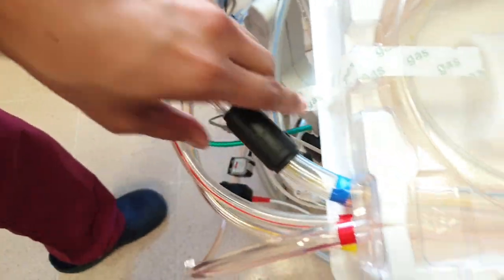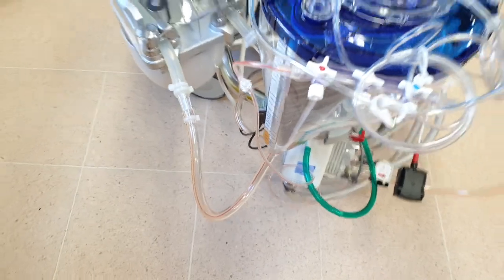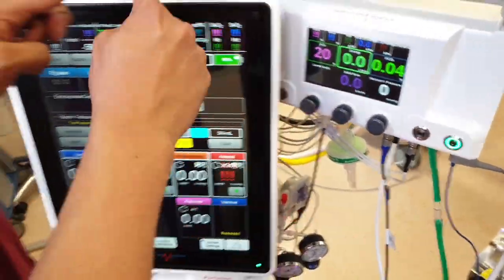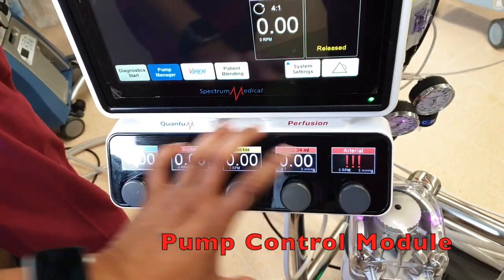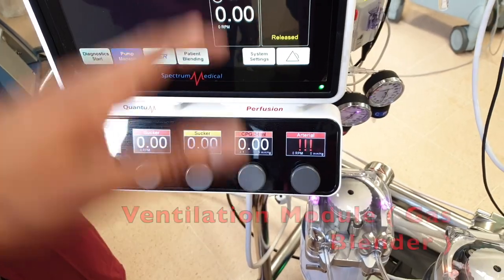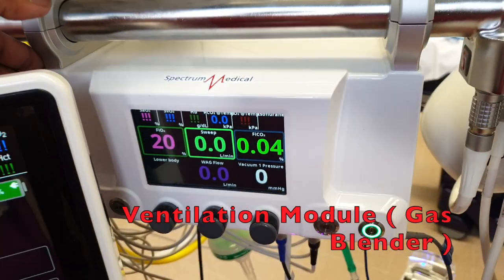So at least we've got how many probes? 1, 2, 3, 4, 5, 6, 7. 7 probes. QWS. This bit, the screen. And this bit is the pump module. Pump module. So where you control the pump, like the old knobs. And this is the ventilation module, that's for your blender. So that's the three main bits.